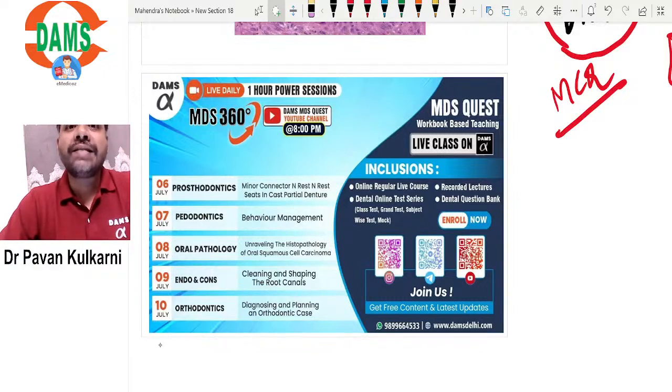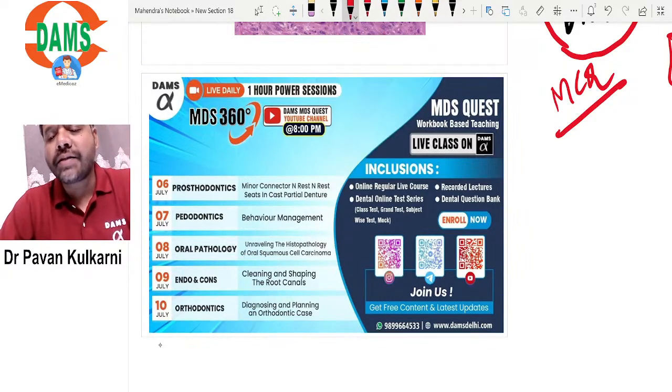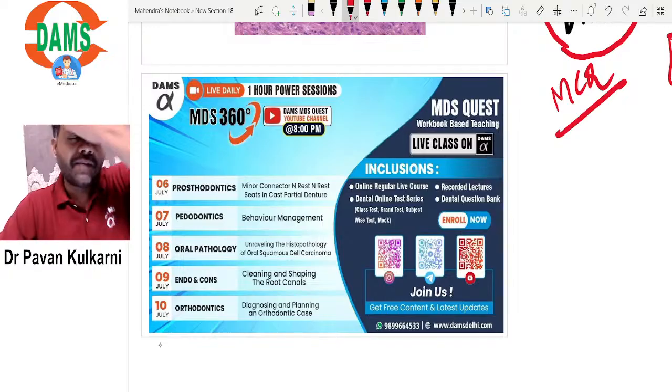In poorly differentiated there are more chances of lymph node involvement and metastasis, and hence the prognosis will be poor. That is the reason why you have to understand the grade of squamous cell carcinoma. That is the Broders grading that has been given, well, moderate and poor. That has been advocated and implemented by even WHO.